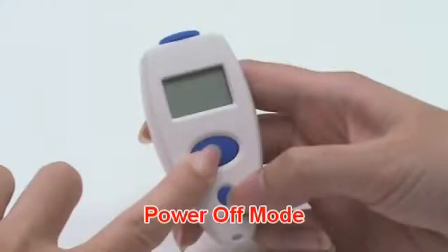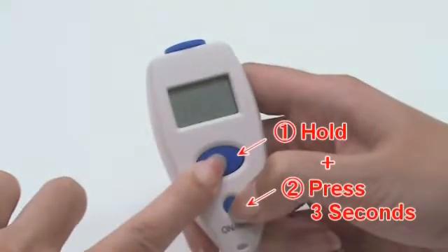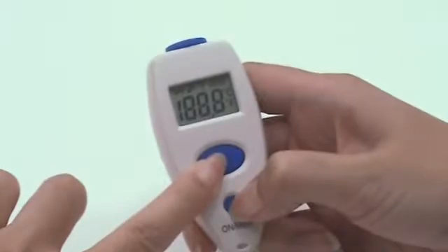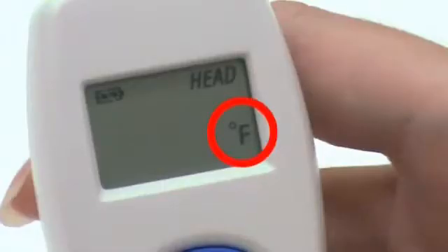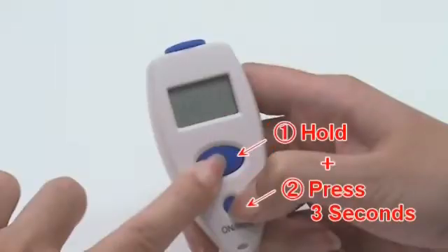In power-off mode, press and hold the scan button, then press the memory button for 3 seconds. The Celsius icon will be switched to the Fahrenheit icon. You may also use the same process to change back from Fahrenheit to Celsius.